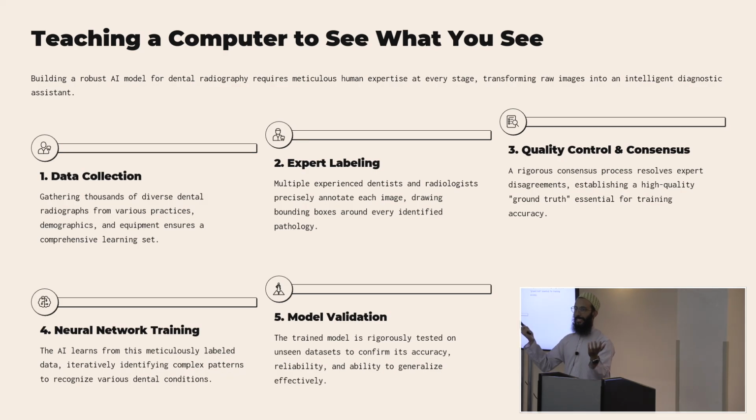But an important thing to note is that when you send a radiograph to Pearl, it doesn't automatically make the AI better. The notion that AI will automatically make itself better is mostly a misnomer, especially for applications like this. The radiograph goes, and if they have permission to use it for training, then it'll get annotated. And then that annotation will help train a model, and usually months later, that will make it into the model that you use on a day-to-day basis.